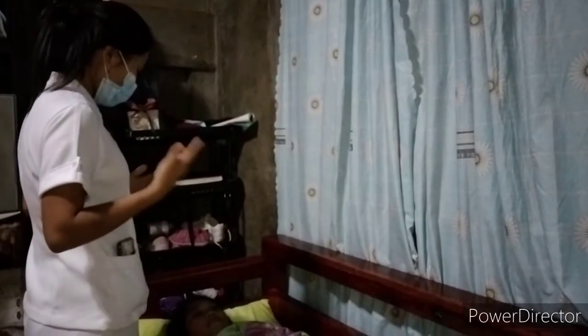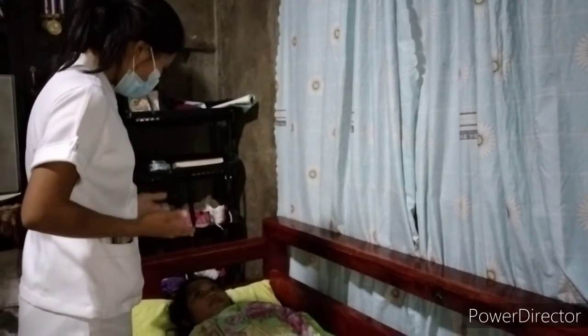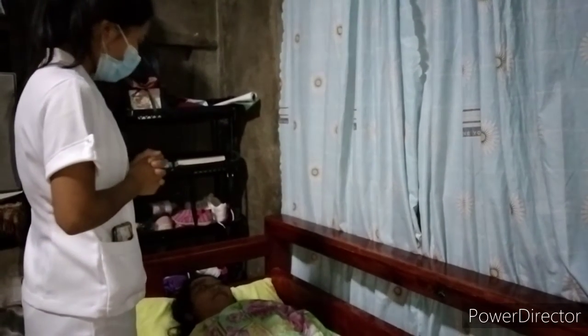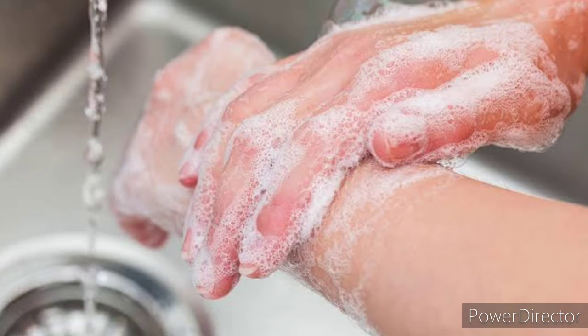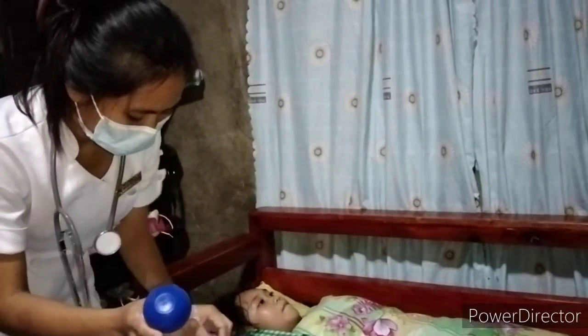Step number 1. Explain the procedure. Discussion and explanation help allay anxiety, encourage patient cooperation, and prepare the patient for what to expect. Second, perform hand hygiene to deter the spread of microorganisms. Third, prepare feeding container to administer formula.